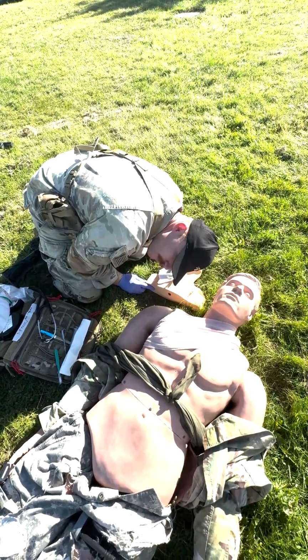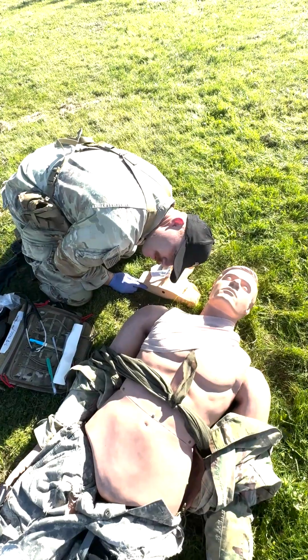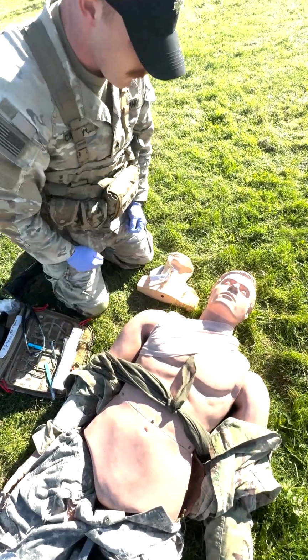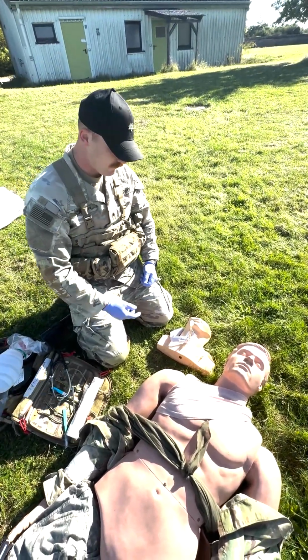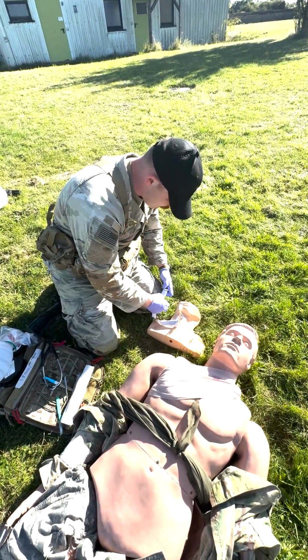2, 3, 4, 5, 6, 7, 8, 9, 10. In 10 seconds, you observe 3 respirations. The patient has a pulse oximeter reading of 95%. Alright, perfect. This casualty does not need any additional ventilations. I'm going to go ahead and secure my cric tube.